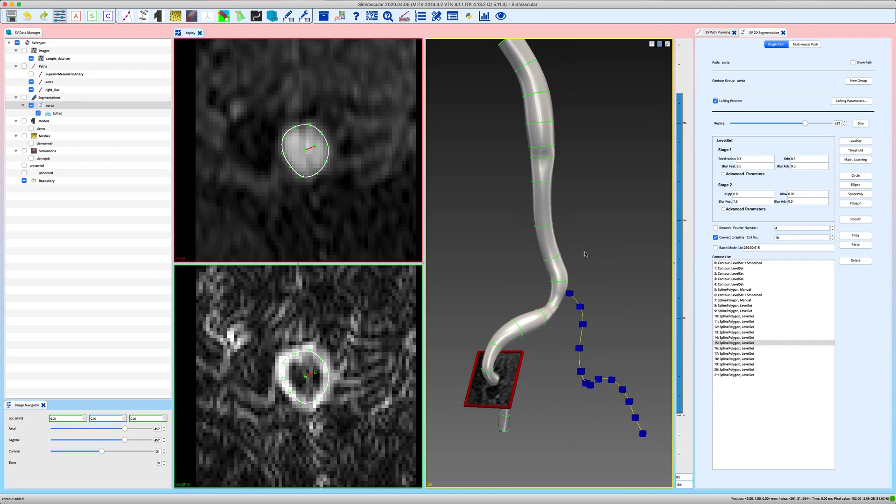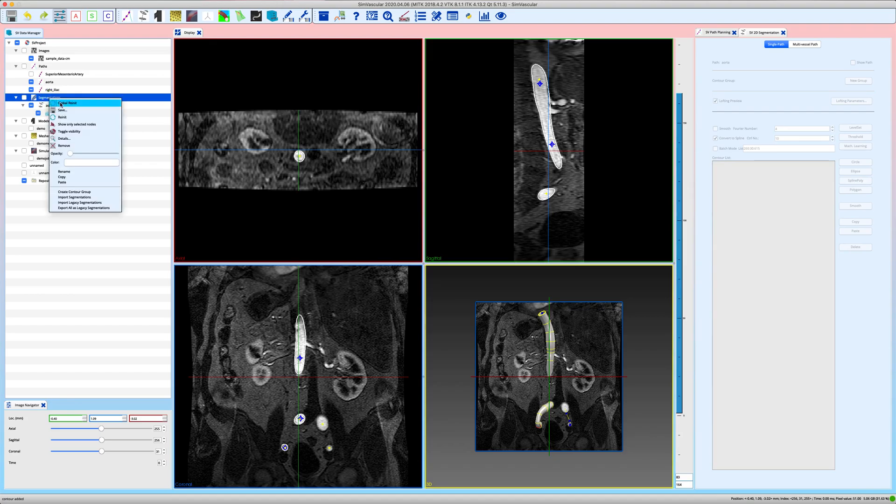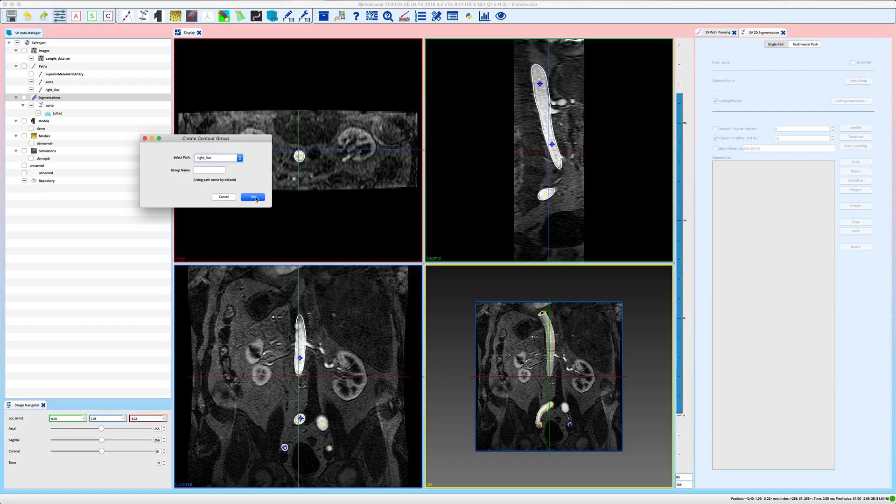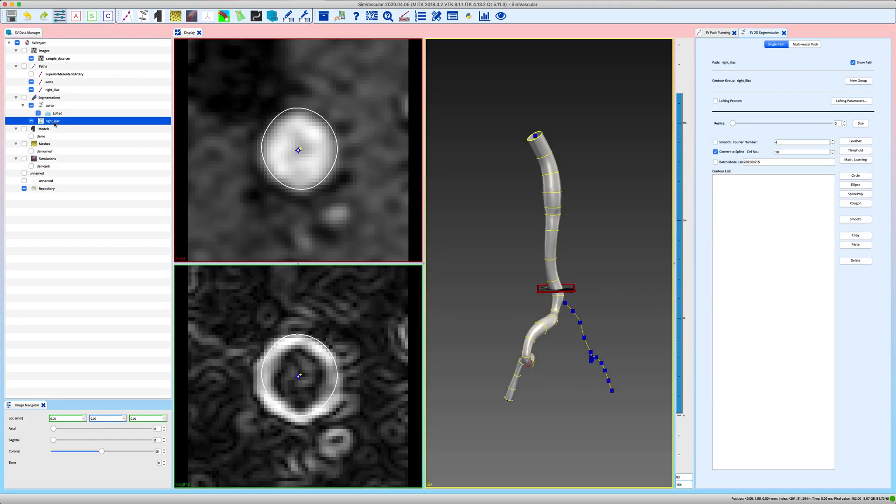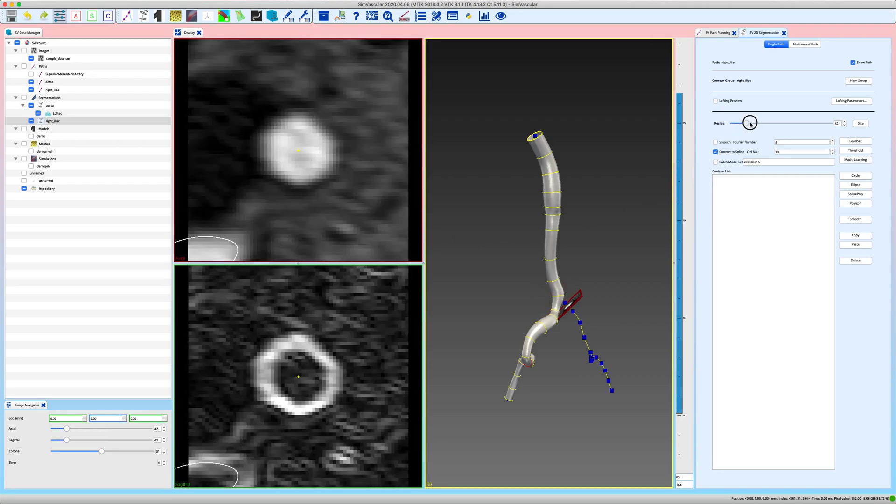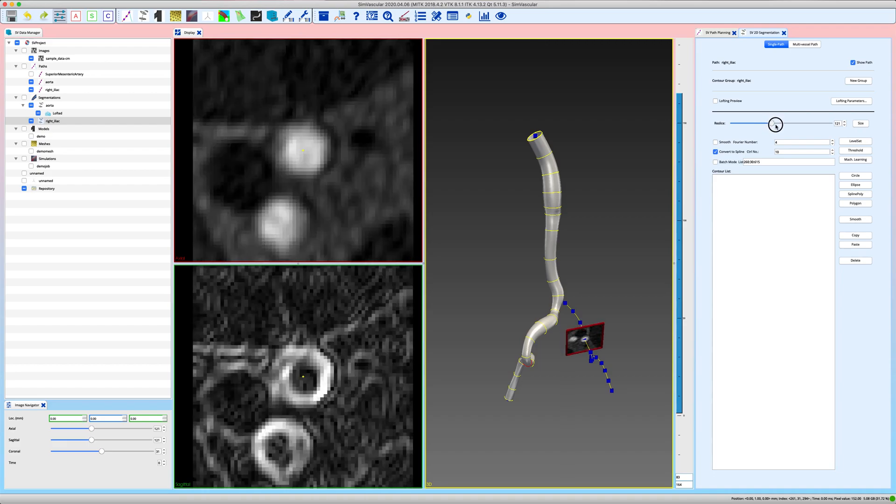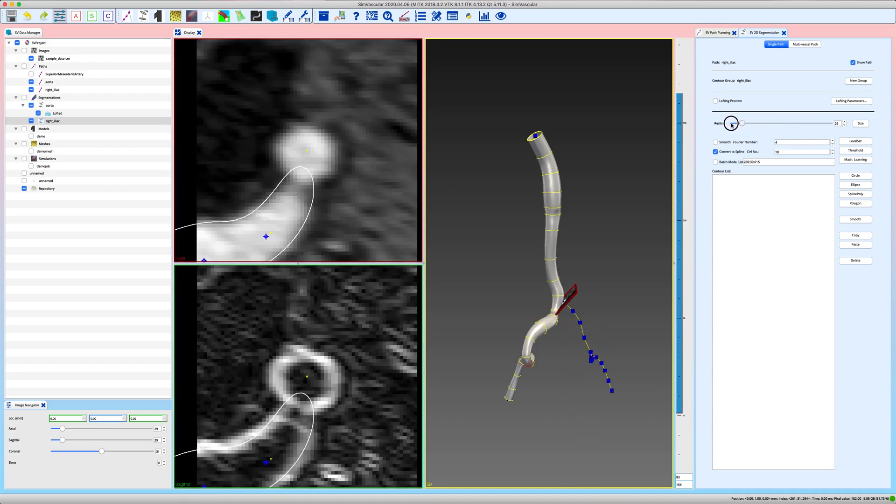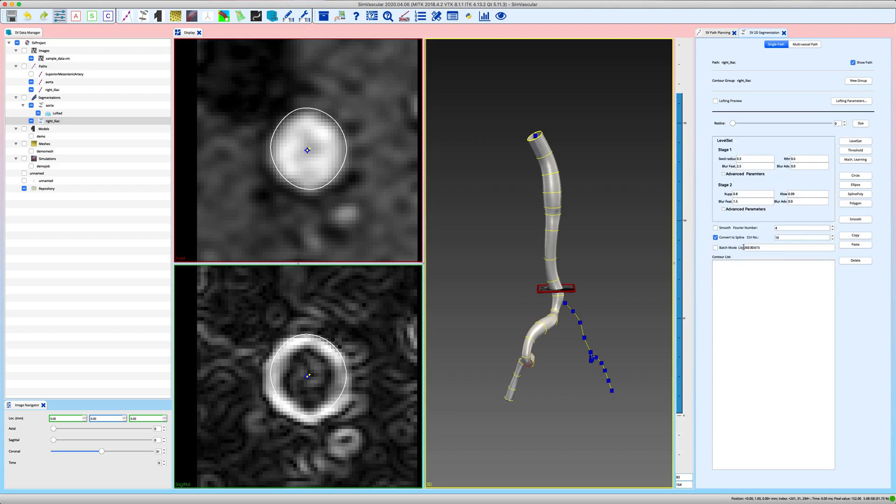And something else that we should mention here is how you segment the intersections of two vessels. So let's create a second contour list of the right iliac. Again create contour group. Now we choose right iliac. I'm happy again with the default name so I just click okay. The right iliac group is generated and we have our reslice window now starting in the right iliac and following the path of the right iliac.